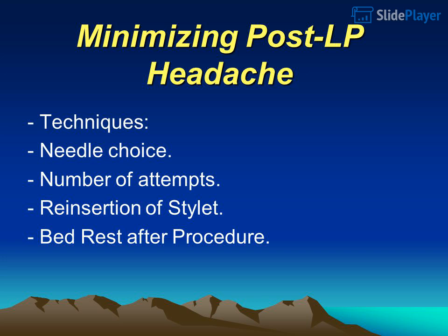Minimizing post-LP headache. Techniques: needle choice, number of attempts, reinsertion of stylet, bed rest after procedure.